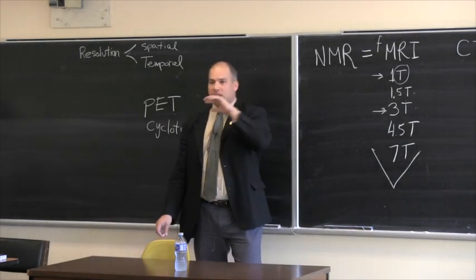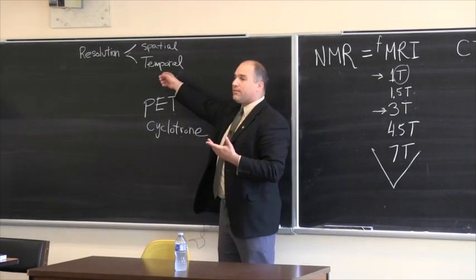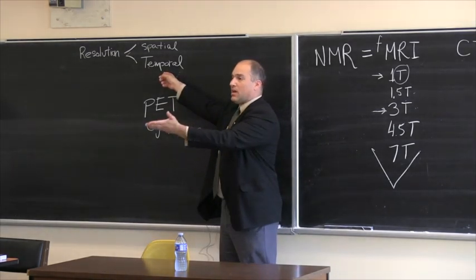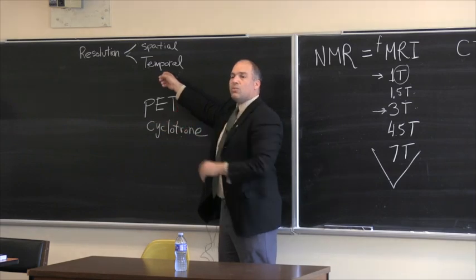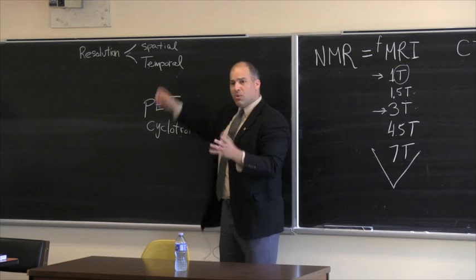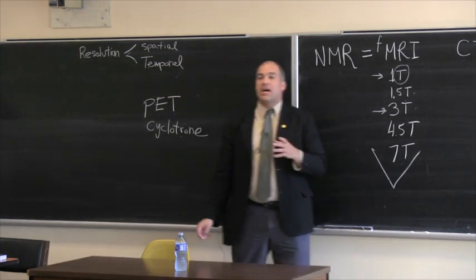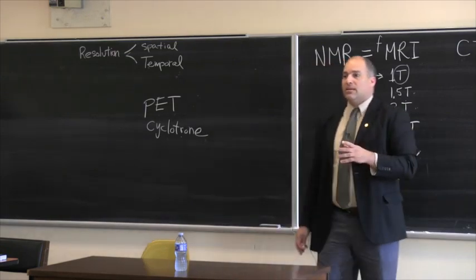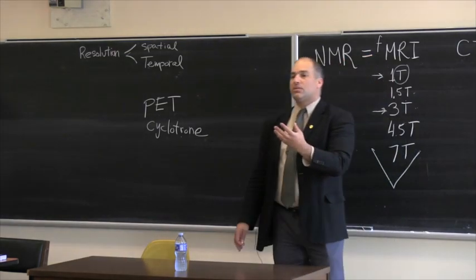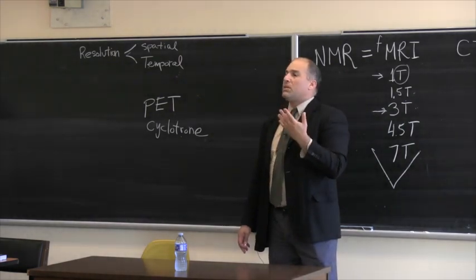Why? Because this is a very different process that calls for a very different temporal resolution, and this is exactly what I was trying to make. What's the time resolution of PET? Do we know? More or less. When I said 1 second for MRI, I was very kind to fMRI. But what is the temporal resolution of PET? Let's think about what it does.